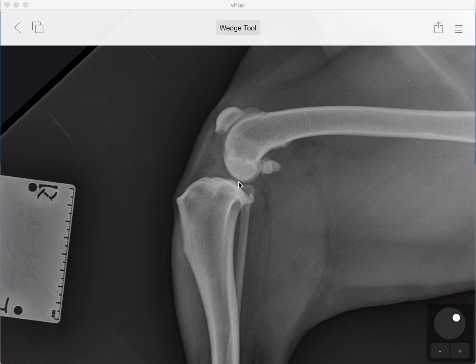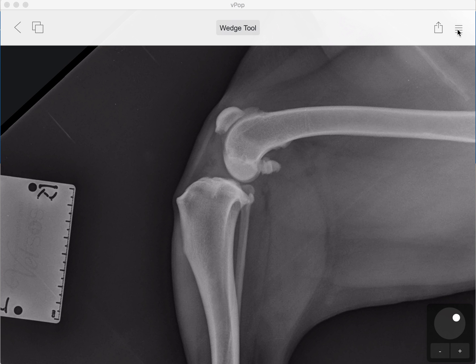Welcome to the sixth instructional video of VPOP Pro. In this video we're going to be learning about the wedge tool, which is found in the tools section of your menu. There are three parts to the wedge tool and we'll take you through them one step at a time. This is not a video for a full plan of a cranial closing wedge or angular limb deformity correction — it is simply your introduction to the wedge tool.